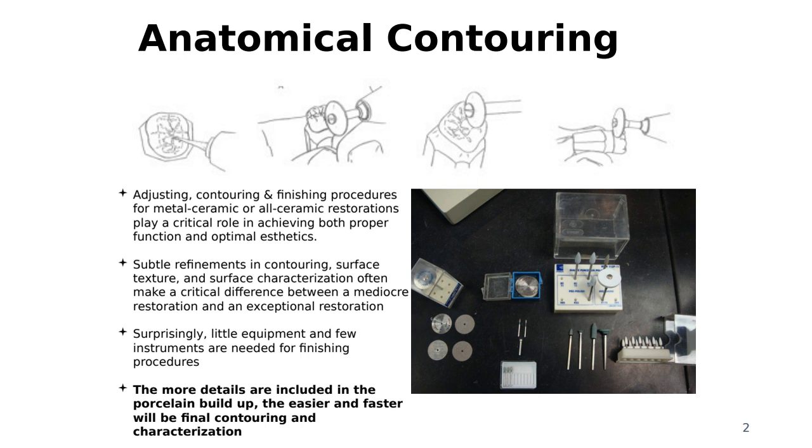Who do you think I learned more about the stones and the burrs to use on zirconia from? From the dentist or from those continuing education courses? No, it was from the sales representative, because they came and told us, hey, listen, they made this kit especially for zirconia, and this is the grit, and this is why it works, because it doesn't heat too much. It's a stone that stays cool, so it doesn't transfer heat to the material, and all that fun stuff. And they would let us try it.